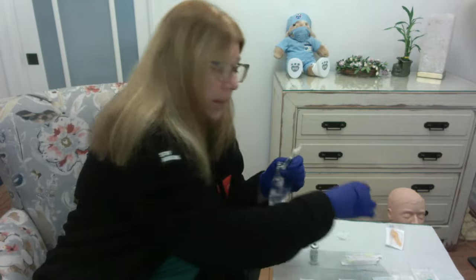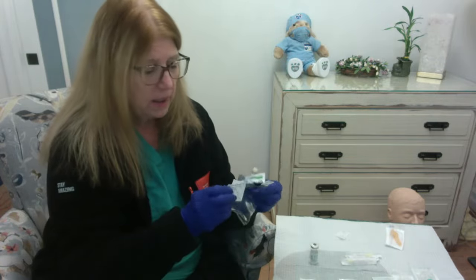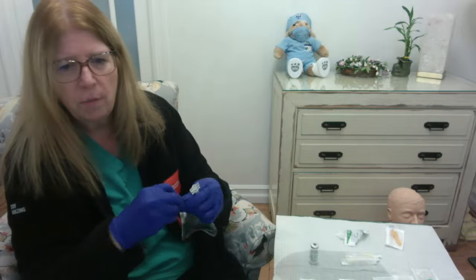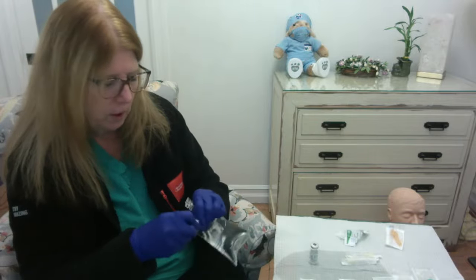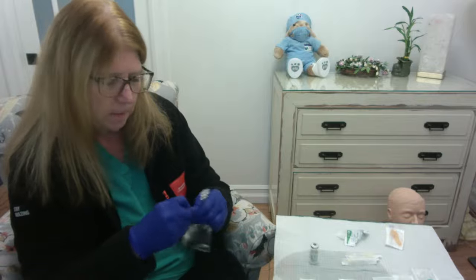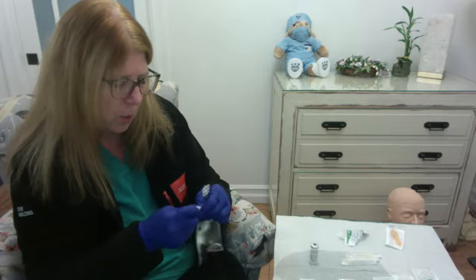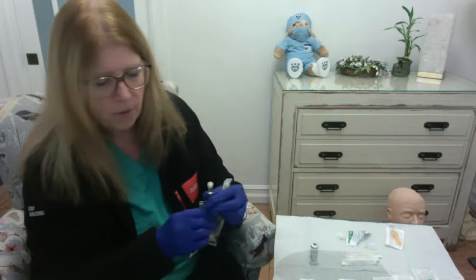So I need another alcohol swab. I need to clean off this port, right? So I'm going to scrub this hub for 30 seconds, okay? Then I'm going to make sure not to put the bag down or to touch that port in any way. I've scrubbed the hub for 30 seconds.